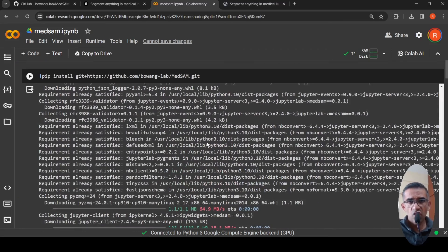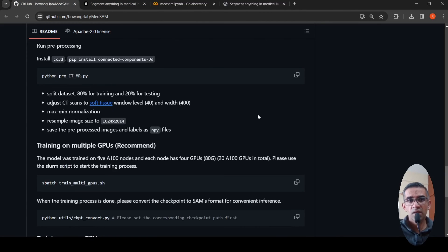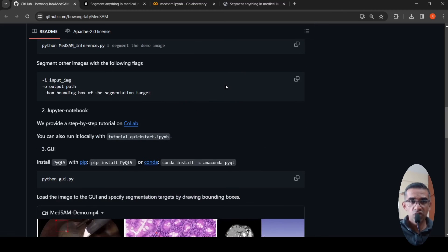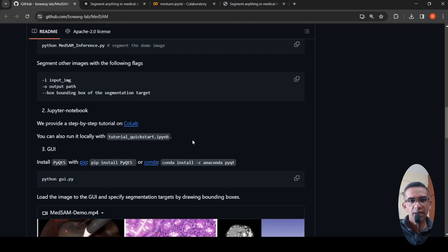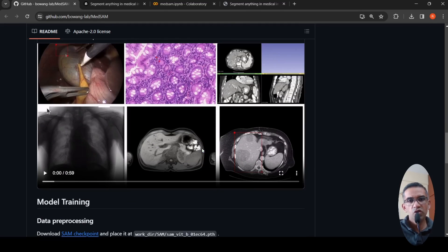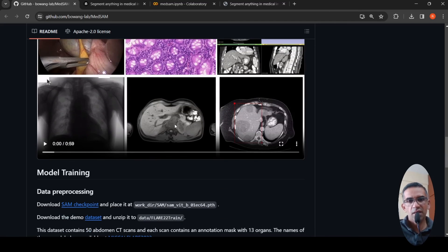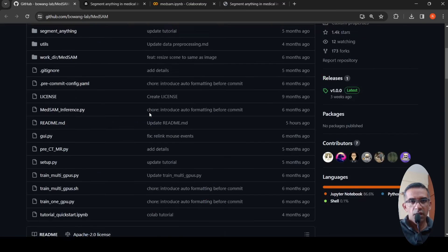They also provide a graphical user interface where you can load the image and specify segmentation targets by drawing bounding boxes. You can download it on your machine and run it locally. Using the GUI, you can mark bounding boxes on the image, pass it to MedSAM, and see the segmentation results.